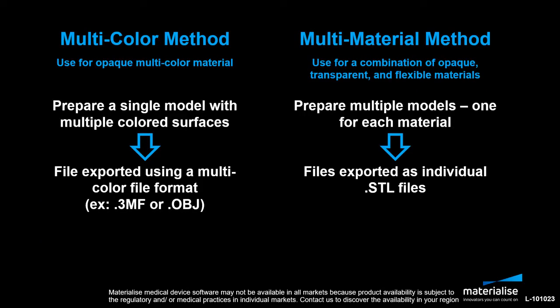The multi-color method would be applicable when using an opaque multi-color material. In this method we will prepare a single model file with various colors assigned to the surfaces. This file can be exported using a multi-color file format like 3MF or OBJ, transferring the color assignments directly to the build preparation step.